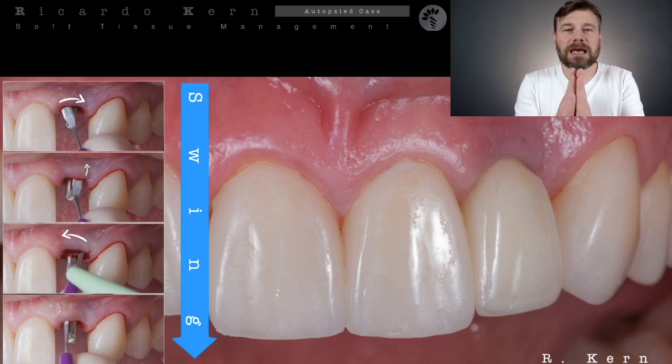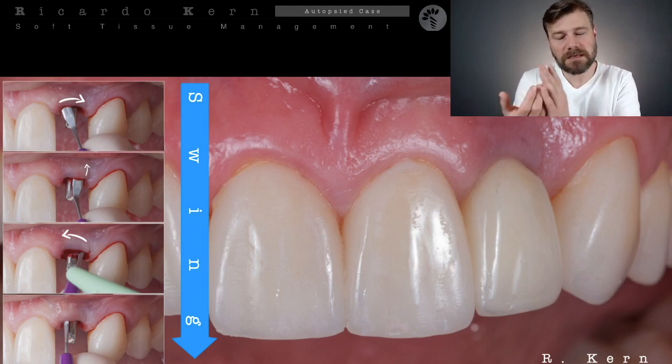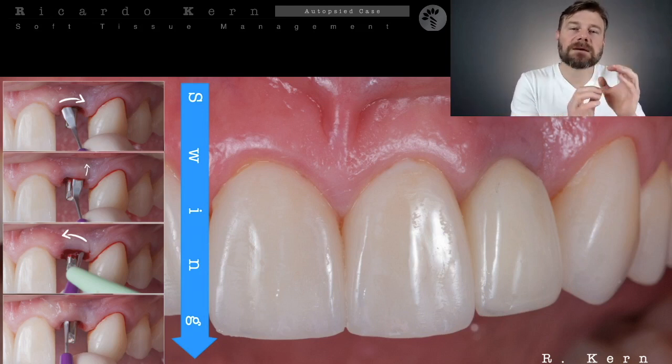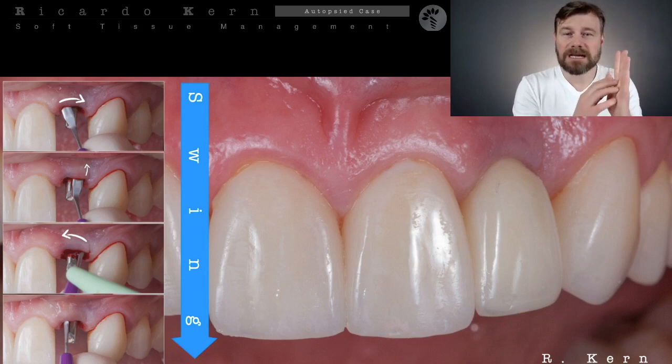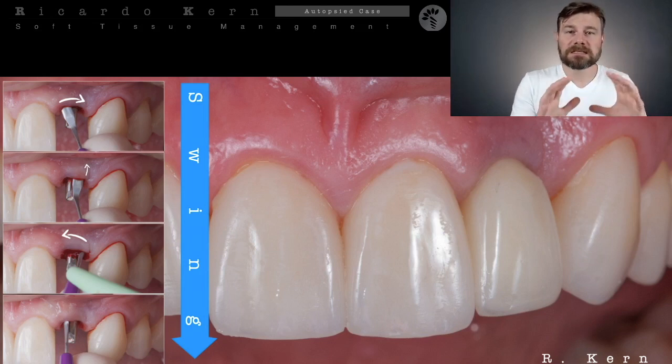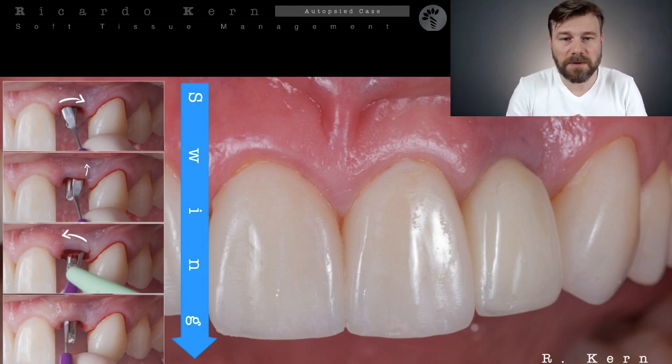We're going to leave as much thickness as possible on the surface, but you're still going to leave some parts of the periosteum on the ground, protecting the bone, nourishing the bone on the threads that may have some exposure, maintaining this bone in place, and of course maintaining the biologic width around this abutment and around this implant, okay?